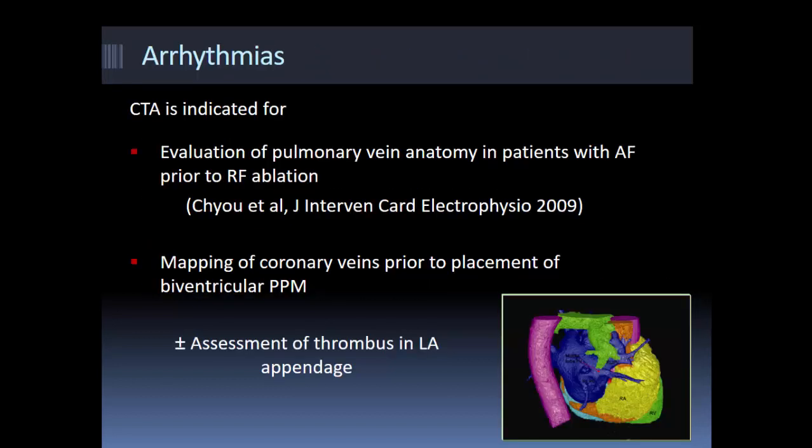And the third thing is assessment of thrombus in the left atrial appendage. So we know that TOE is the gold standard for that purpose, but CT done rightly is also a very excellent non-invasive technique to exclude left atrial appendage thrombus.